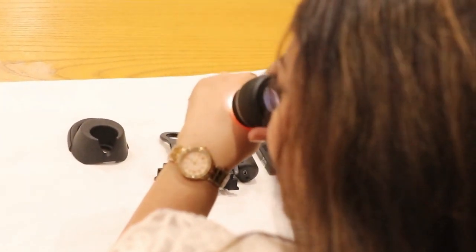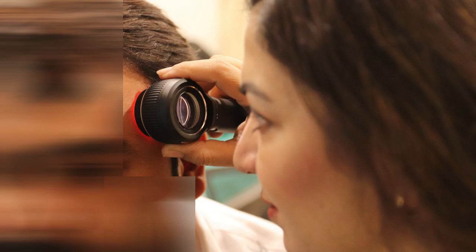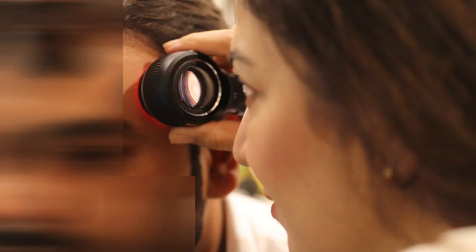You move clockwise and anticlockwise according to your reflection, and where you see finer details and a very clear cut image, there you stop. Cordless devices that are in polarized mode should be at least 10 times magnifying than the clinical image, and should be able to be attached with the cell phone. Thank you so much.